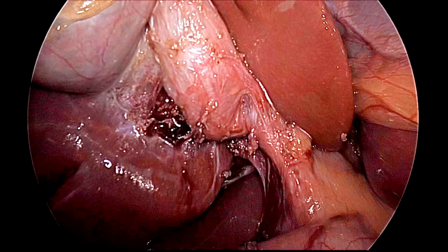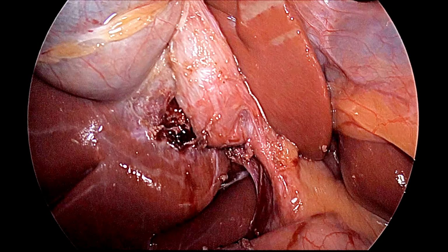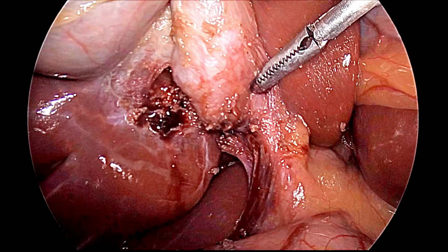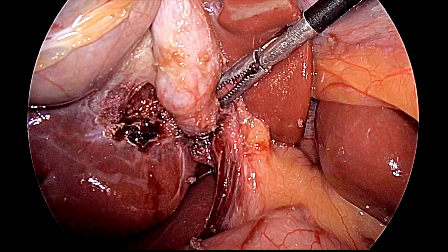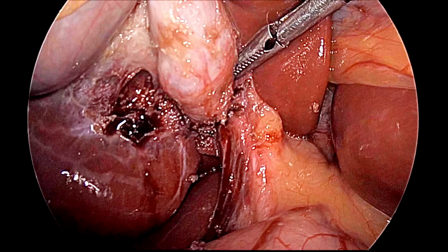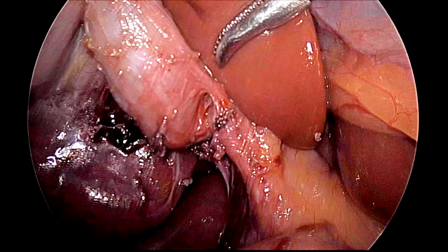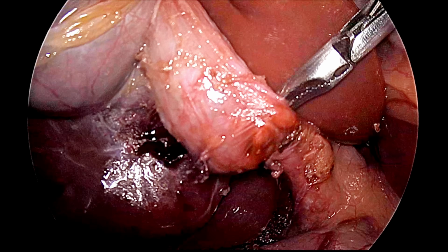This patient has a very short cystic duct, and tenting of the CBD is visible. So we have to be very careful. In a short cystic duct, you should try to be more careful. So this is a dissection in between the artery and duct. So this is the cystic artery.